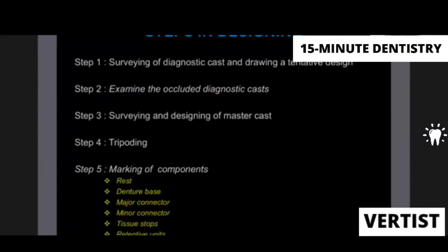Surveying will include surveying of the diagnostic cast and drawing a tentative design. You examine the occluded diagnostic cast. You survey and design your master casts after you make your final impressions. You do tripoding, and then you mark your components.